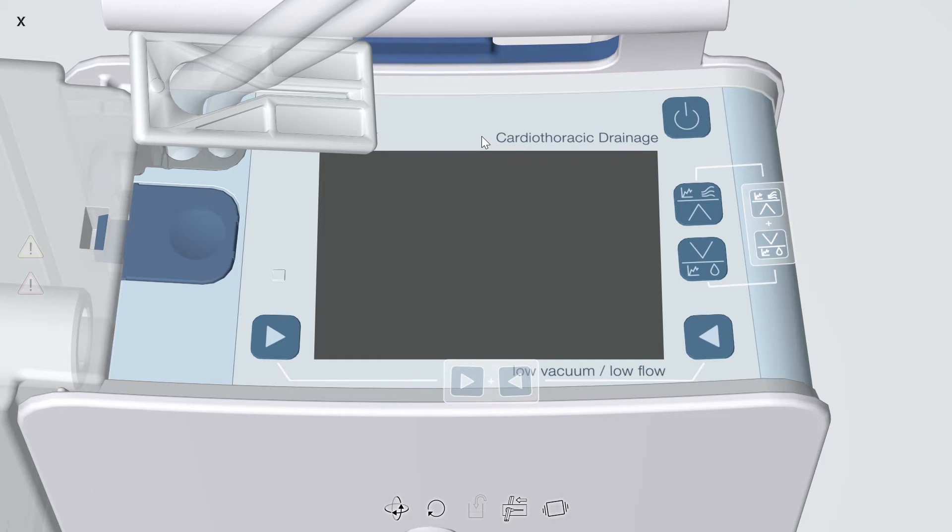On the top of the device is the canister release button, the display, the power button, the up and down selection arrows, and lateral left and right option button arrows. The function of the lateral left and right option arrows changes depending on what screen you're on.